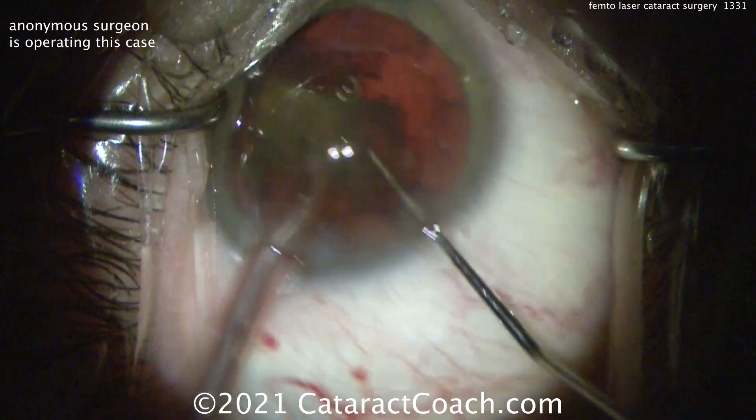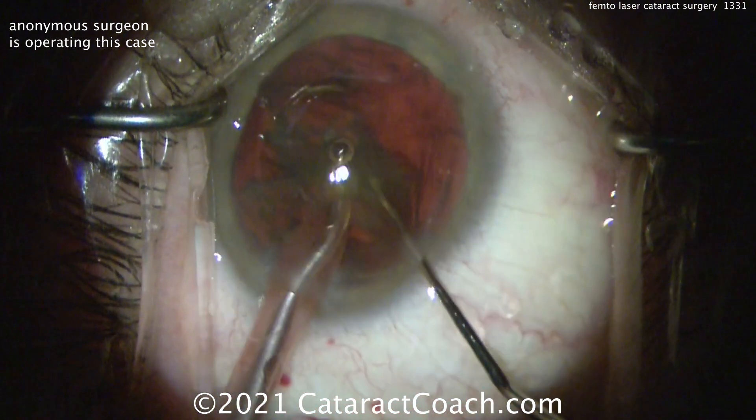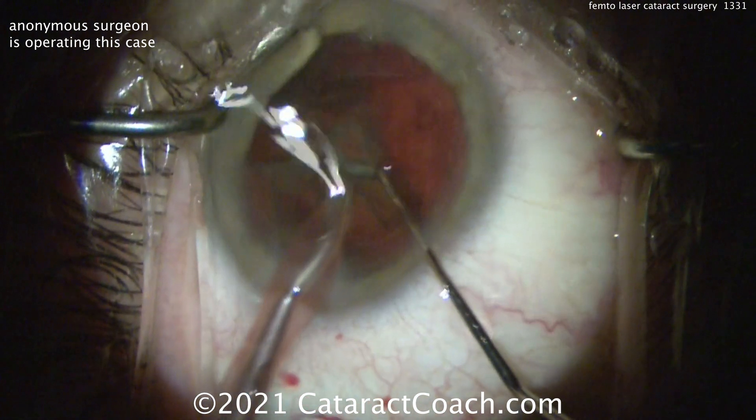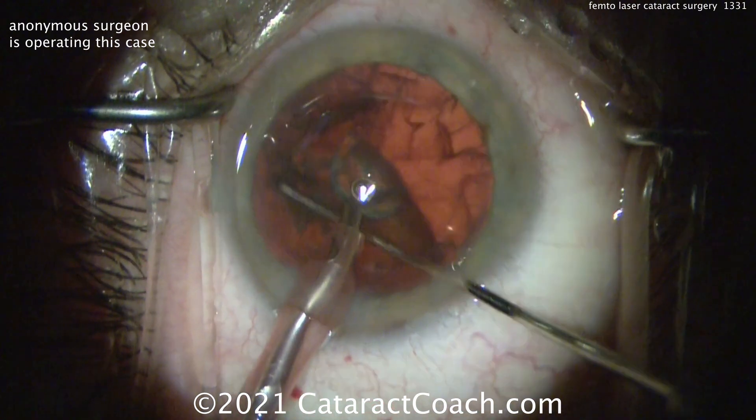So if you're a patient watching this — look, even with the laser, you've still got to put the phaco probe in the eye. The laser's not some kind of magical trick. You still need to have a good surgeon. Just a couple of the steps are done for the surgeon.